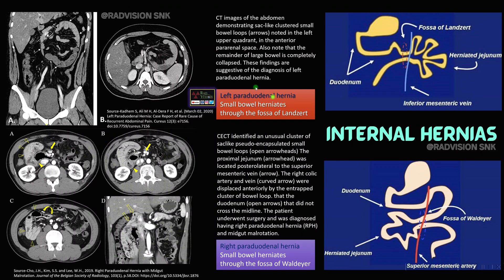Next we will see a few internal hernias. Here you can see a sac of abnormal bowel loops on the left side of the abdomen, anterior to the kidney — this is a left paraduodenal hernia, which commonly occurs through the fossa of Landzert, where small bowel loops herniate. Here you can see abnormal bowel loops on the right side — jejunal loops posterolateral to the superior mesenteric vein, with arrows depicting the right colic artery and vein. This is right paraduodenal hernia, which occurs through the fossa of Waldeyer. Remember: left paraduodenal hernia through the fossa of Landzert, and right paraduodenal hernia through the fossa of Waldeyer.